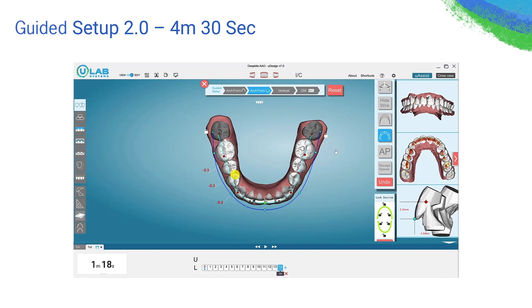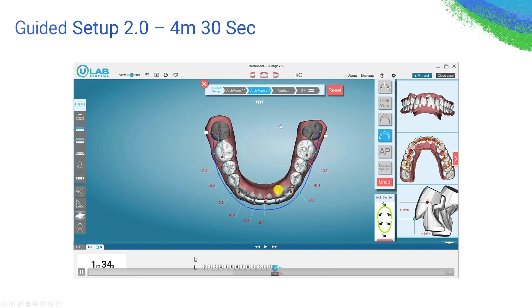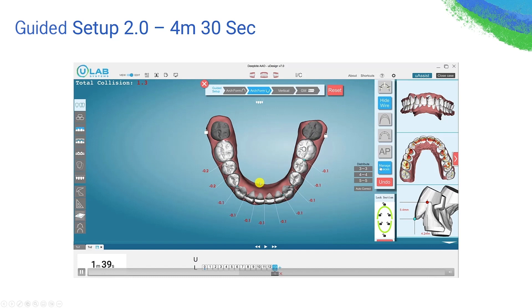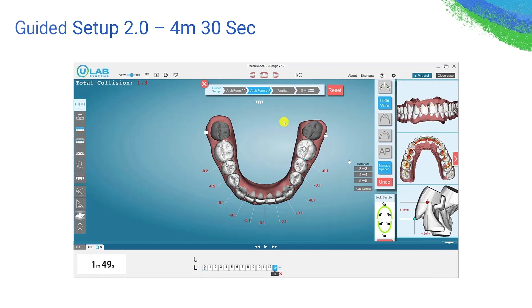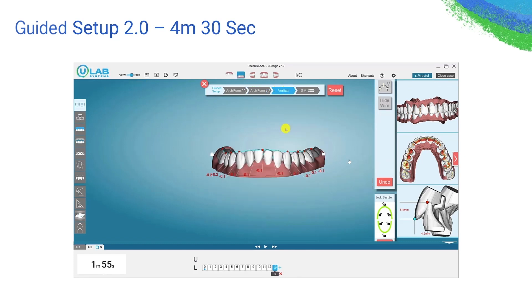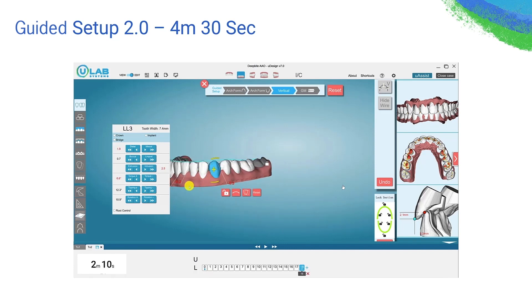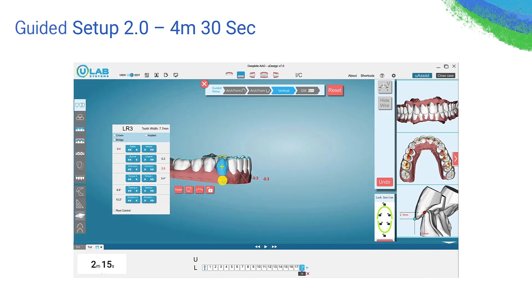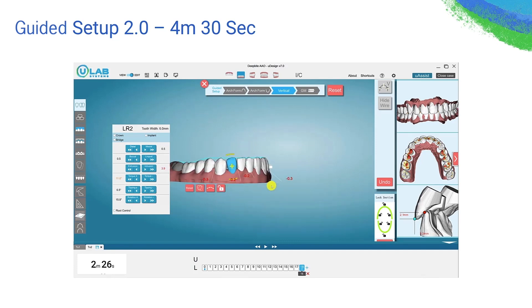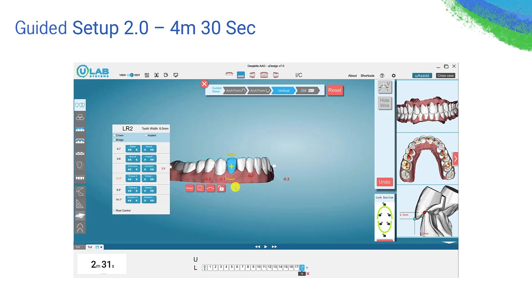We recommend identifying the arch you would like to work on first as your reference arch. After you build your reference arch — in this case I started with the top — you can adjust the bottom with arch coordination tools and then use space management to distribute your spaces. Start with the arch form and top-and-bottom alignment, then get to your vertical. I can do minor adjustments on the canine very quickly. We're still about two minutes in and finishing this case with a good degree of detailing — this is not just an average setup. I spend a pretty good amount of time to really detail it to the final position.